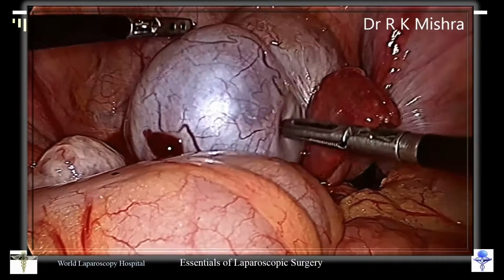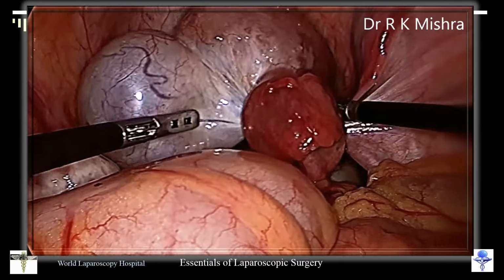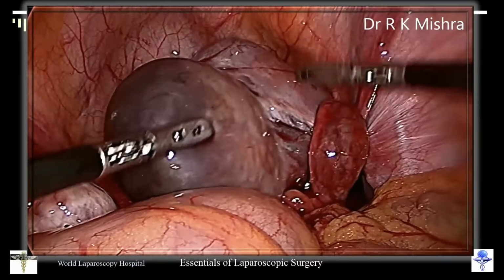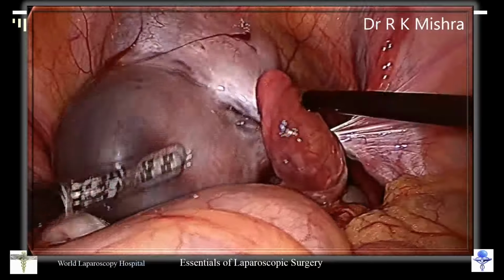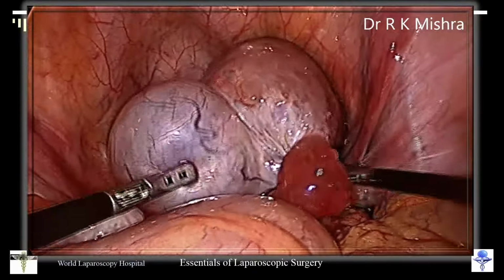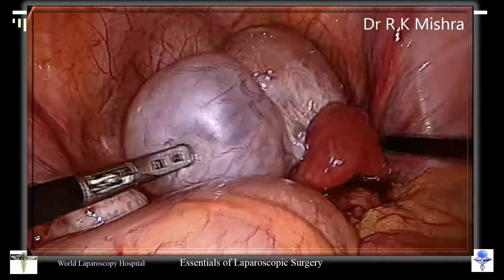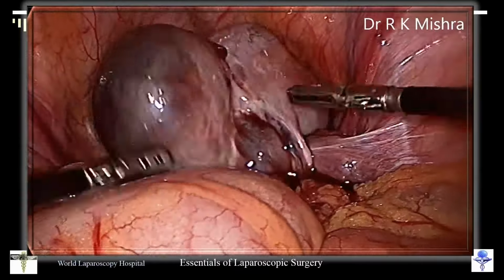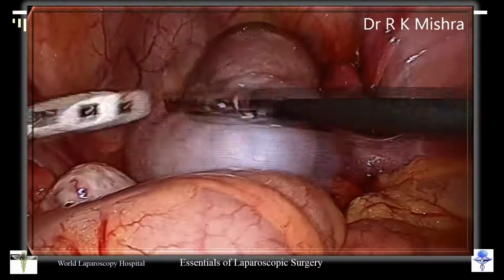Those are the old theory. So, this is detorsion will be done. So, this is contralateral port position, this is one time detorsion, this is second time detorsion, this is third time detorsion, and this is fourth time detorsion.